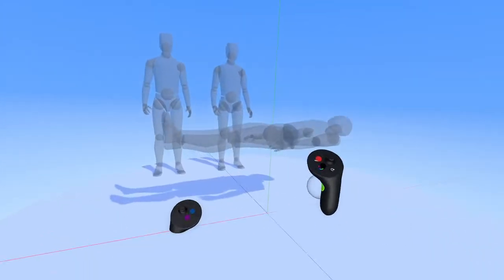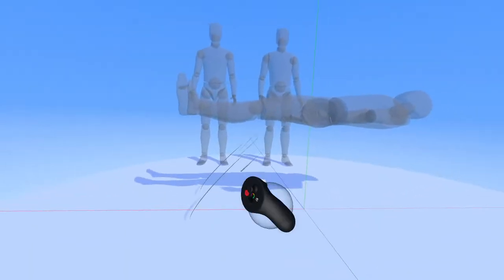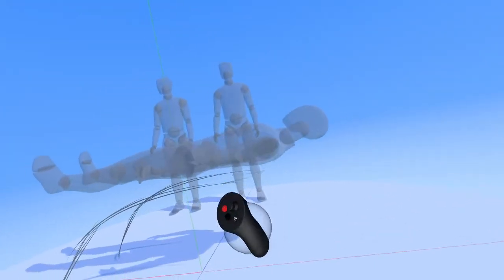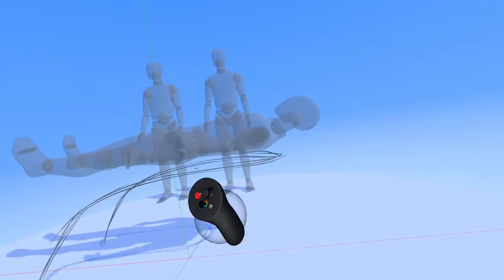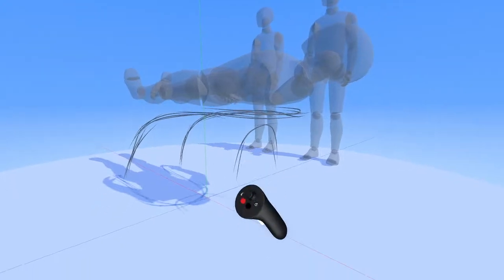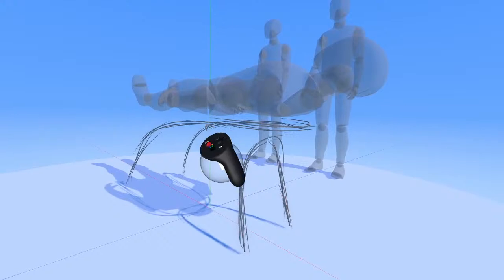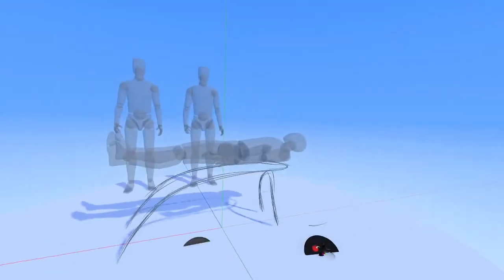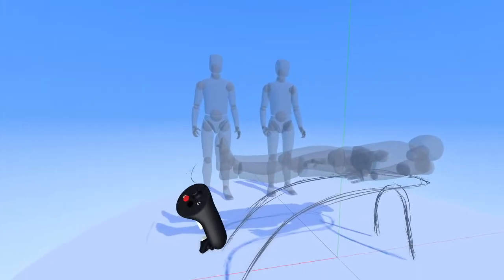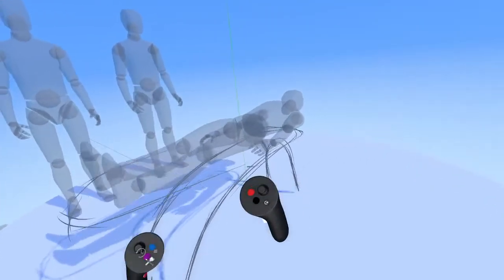All right, let's start sketching. So right now, I'm just going to make kind of like this futuristic looking, or maybe not futuristic, but modern looking patient table. So I'm going to sketch some loose lines like this. And those will be the rear wheels for the table, or the rear legs, I should say. And this will be the front wheels. And then let's sketch the actual bed that the patient is going to be on.